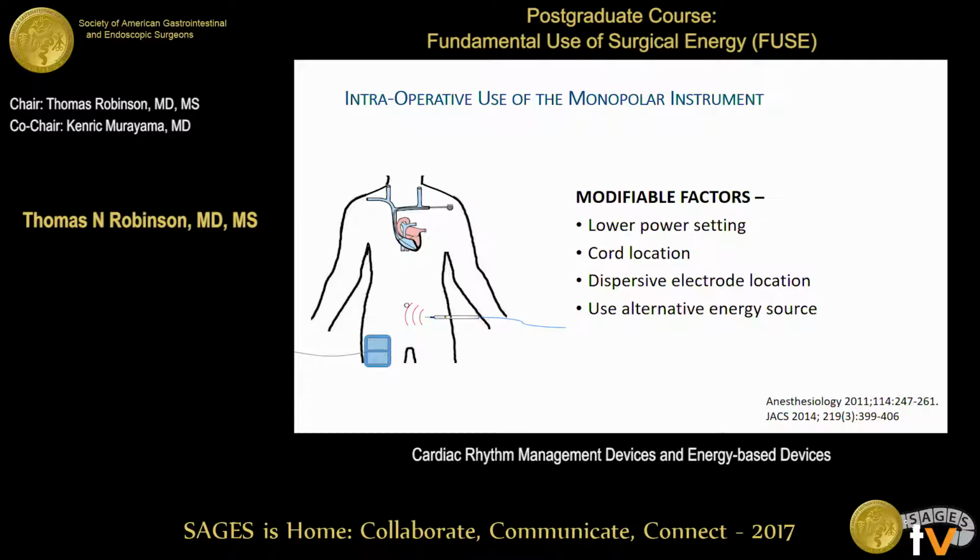I believe that the stem of that question is really the location of your operation. If you're below the umbilicus and you have a pacemaker in place, there is absolutely no indication to put on a magnet. And I believe that's the question that Pascal is getting at. If you have a cardioverter defibrillator, in both instances, whether you're above or below the umbilicus, you should be putting on a magnet. That's what the current guidelines from 2011 say. Any other questions on this? Okay, thank you.